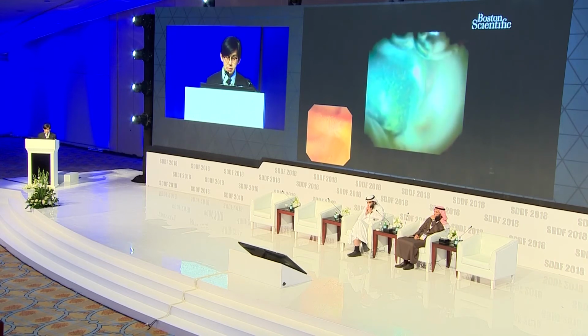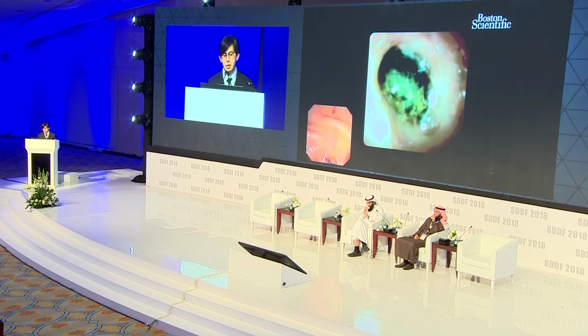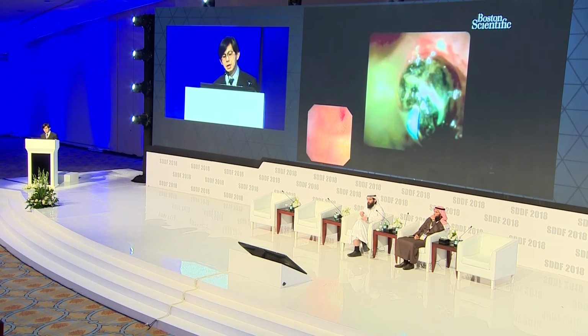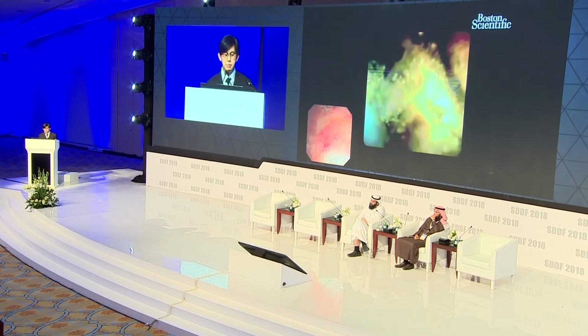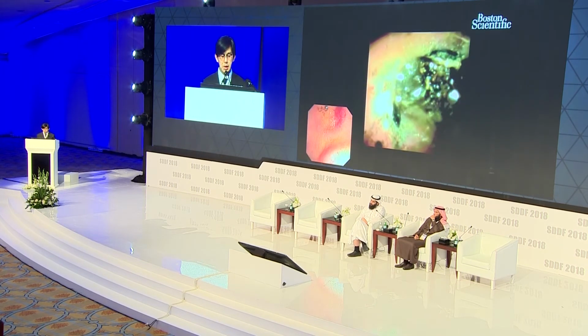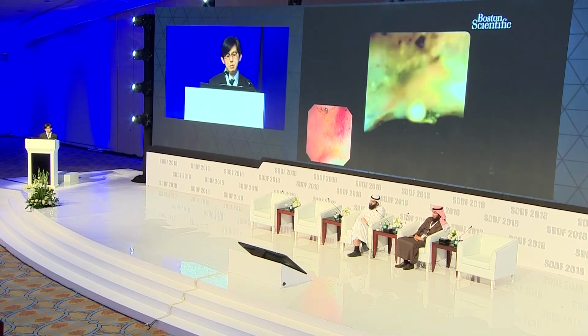In this, you can see towards the right-hand side, bile coming through the cystic duct opening. The stone actually fissured through this Hartmann pouch and eroded into the common hepatic duct. And we used a holmium YAG laser to fragment the stone.